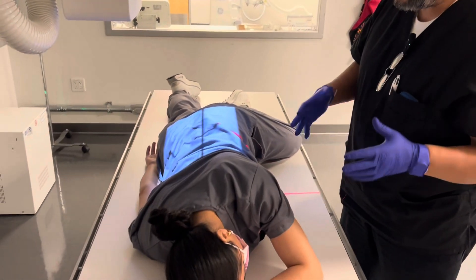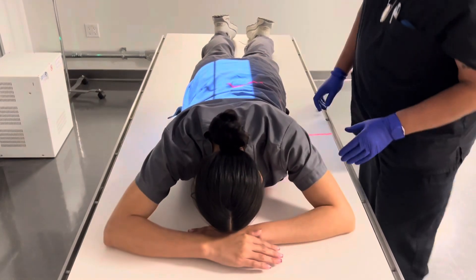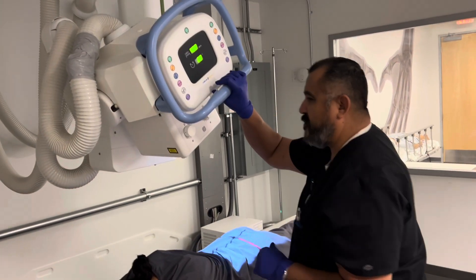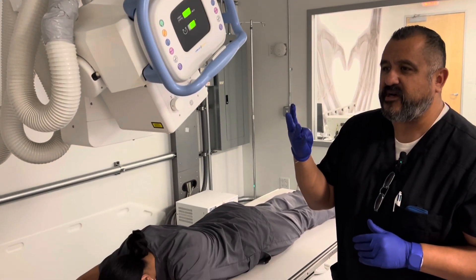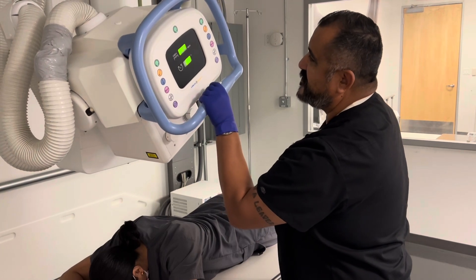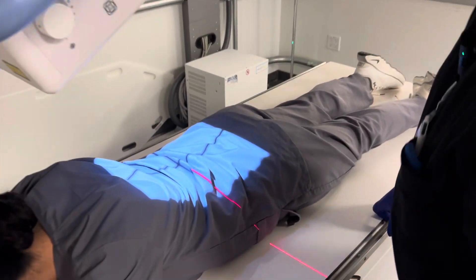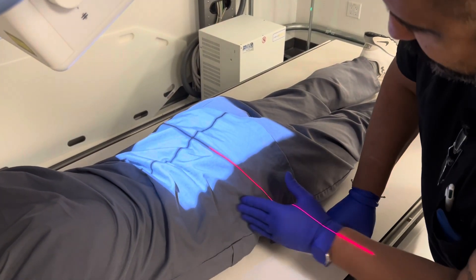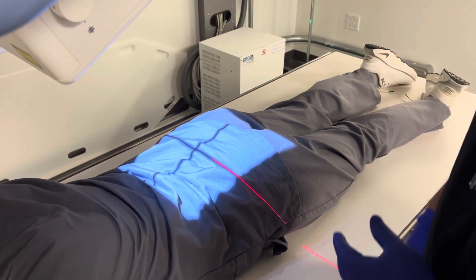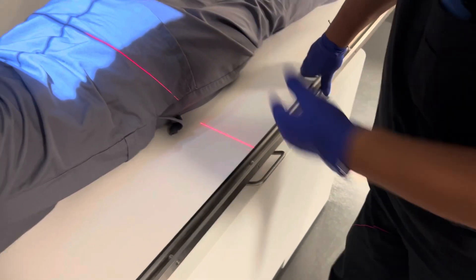Rotating about 45 degrees for the RAO. Now we'll go back flat — put both hands up and return to a PA position. We're going to angle 30 to 40 degrees caudally, so at 30 degrees that's six inches down the track. We go from 40 inches to 34 inches, maintaining a 40-inch SID. Center at the ASIS rather than the iliac crest. This is your PA axial, used to demonstrate the barium-filled rectosigmoid region.